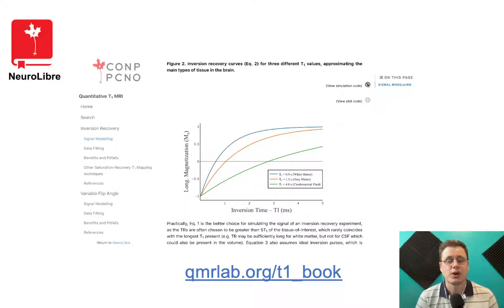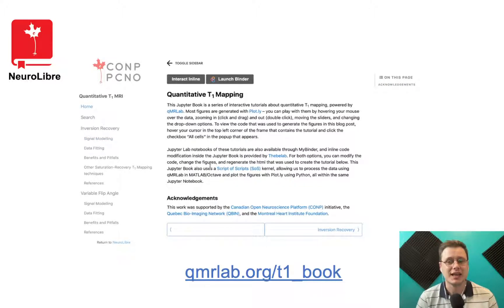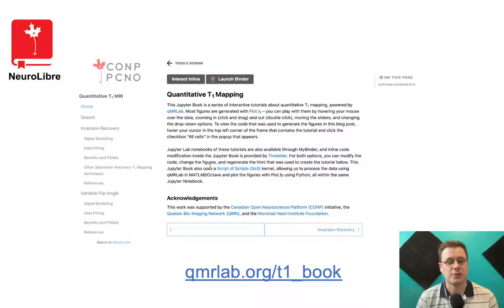If you want to modify the code and re-run the figures with different parameters, you can do so by clicking a Launch Binder button on top of the page, which will open a Jupyter Notebook session in a container so that you can execute the code from your browser — no installation required. Also note that all the code used to generate these figures was using qMRLab.